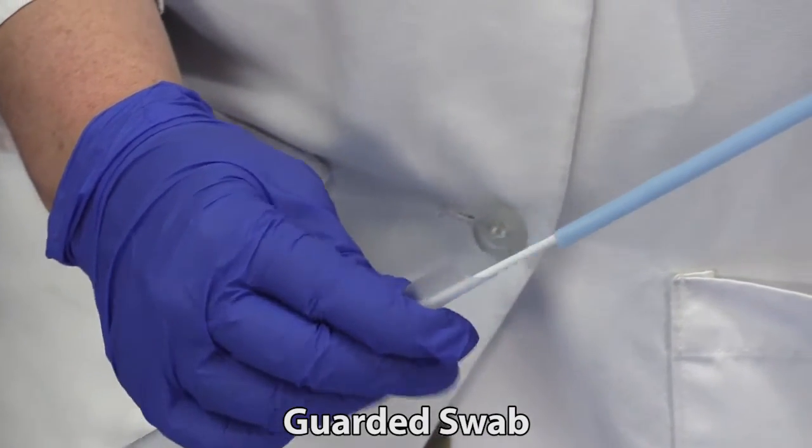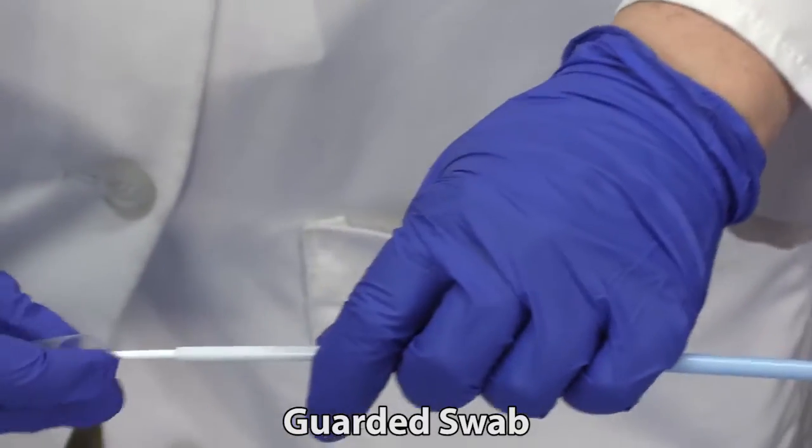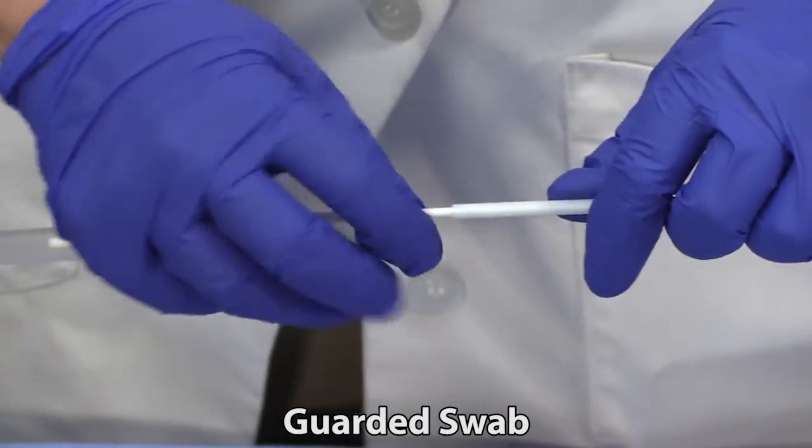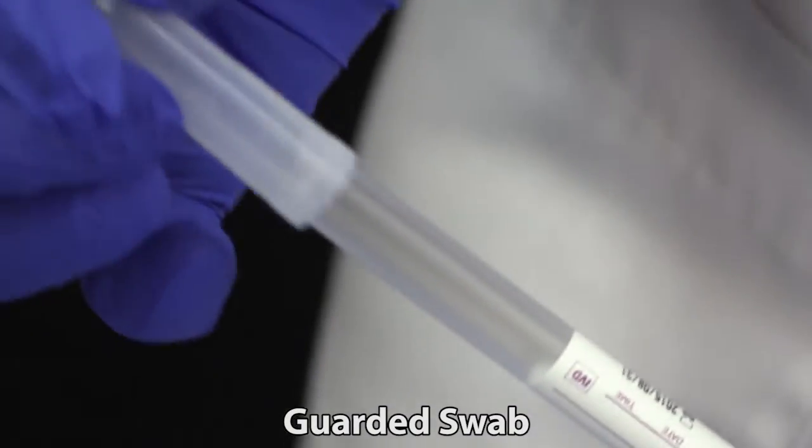The media or container the swab will be shipped in is also an important consideration. There are a number of different types of media available. However, not every type of media is appropriate for every test.